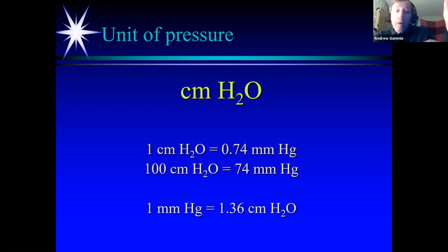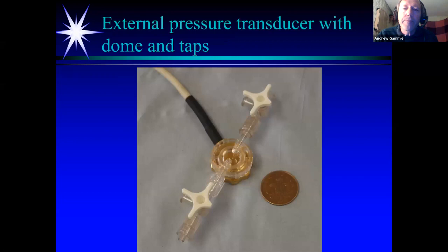When that cuff is attached to your arm, say, and you're looking at the auscultation sound stopping because of blood pressure, blood flow stopping, well, you're looking at how high a column of mercury can be supported by that pressure in the veins. It's the same principle. How high a column of fluid can be supported by the pressure that's generated at the bottom.